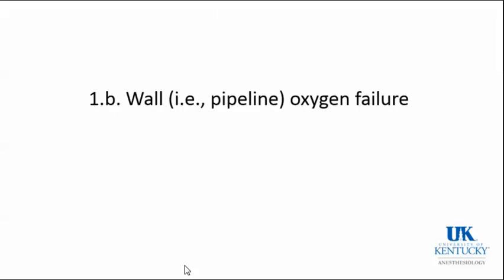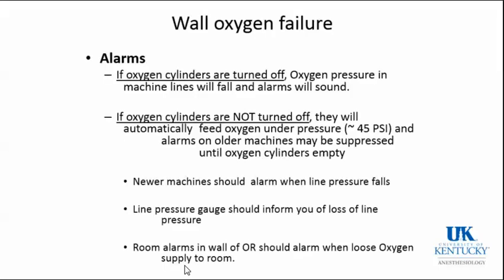A second keyword was pipeline oxygen failure. And a key point here is whether the cylinders are turned off or on.